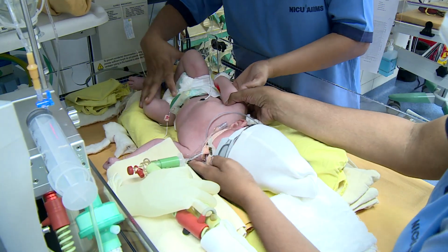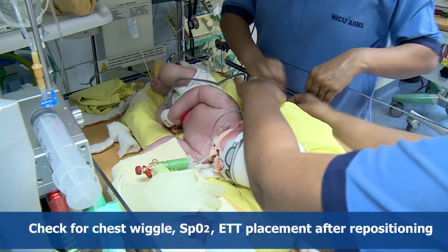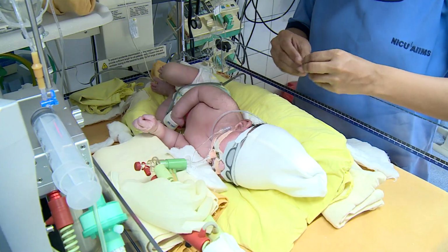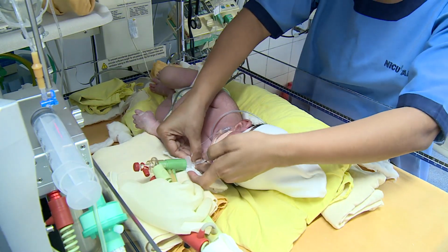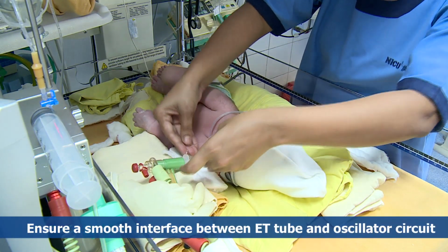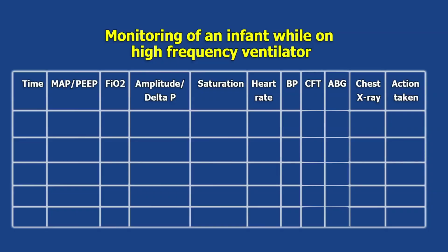Two nurses are required to reposition the baby. Check for chest wiggle, SpO2, and endotracheal tube placement after repositioning. Reposition carefully. Ensure a smooth interface, free of kinks, between the endotracheal tube and oscillator circuit. Document the amplitude, FiO2, MAP and frequency, and auscultation assessment.